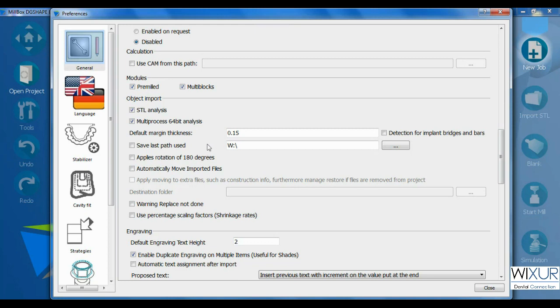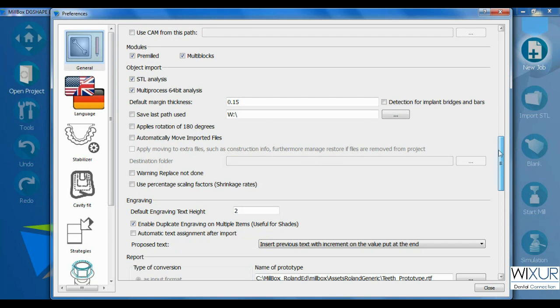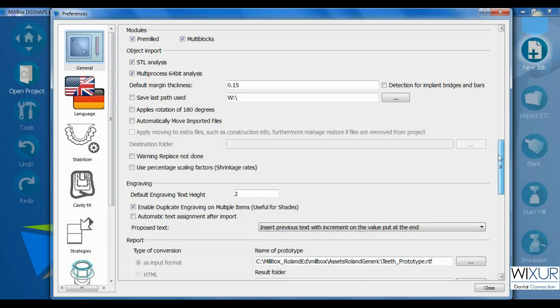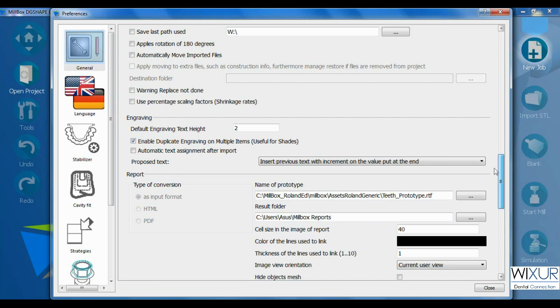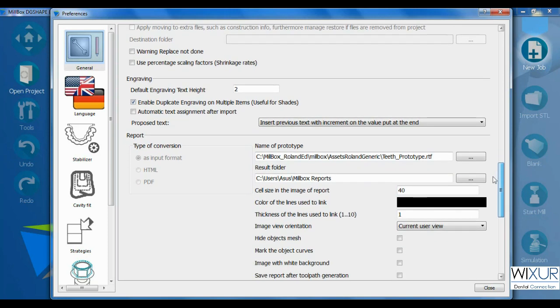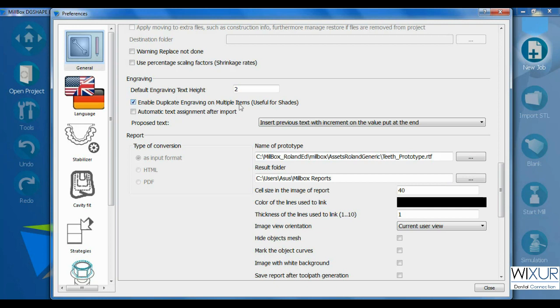In this tab, from object import, the default folder while importing jobs can be set. Engraving—and do not forget to enable this option for engraving if you engrave shades on crowns. This is shown completely in a separate video.